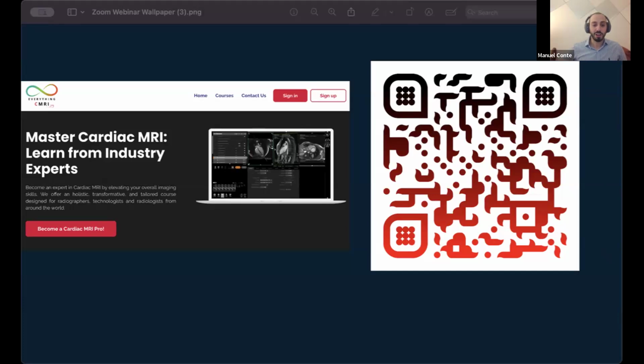No, it was funny because yesterday in the MRI safety WhatsApp group, one of us mentioned these burns after scanning a patient with a double hip replacement. Yeah. So you need to consider that the risk of burns is much higher. So we need to use low SAR and talk to the patient every sequence.